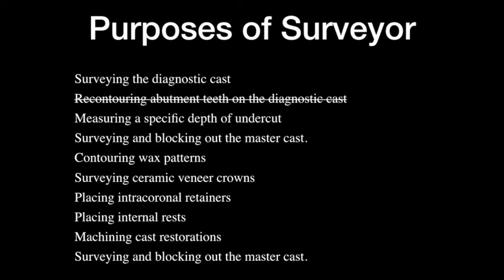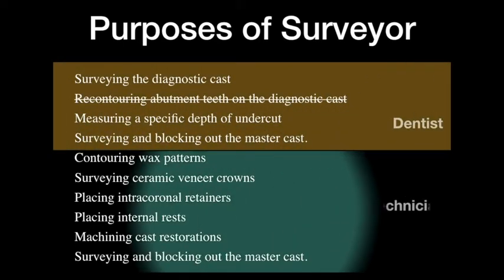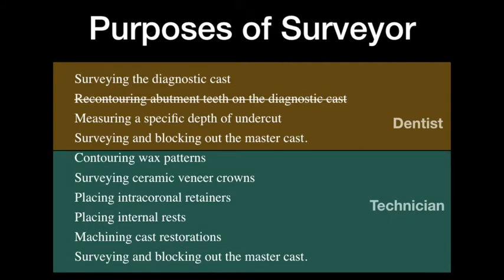Also, you need to know what the purpose is to use the surveyor. You can see those are the reasons why we use a surveyor. However, nowadays, as a dentist, we usually just use the surveyor to do the first three or four purposes, and the others are usually used by the lab technicians to fabricate the framework.